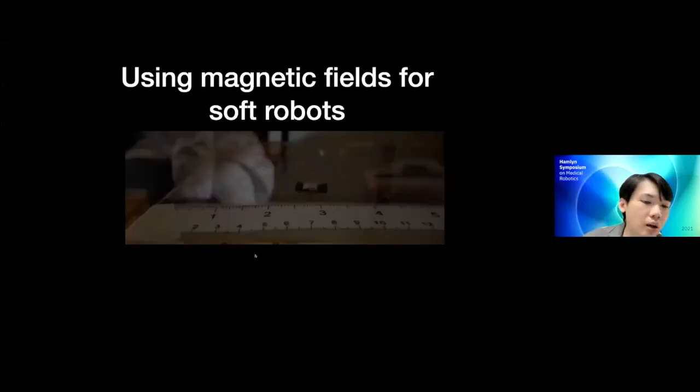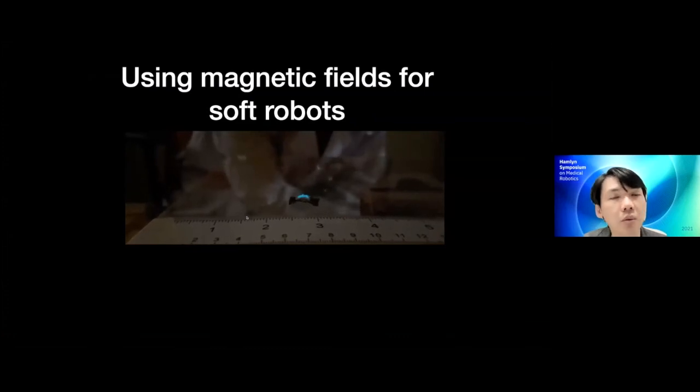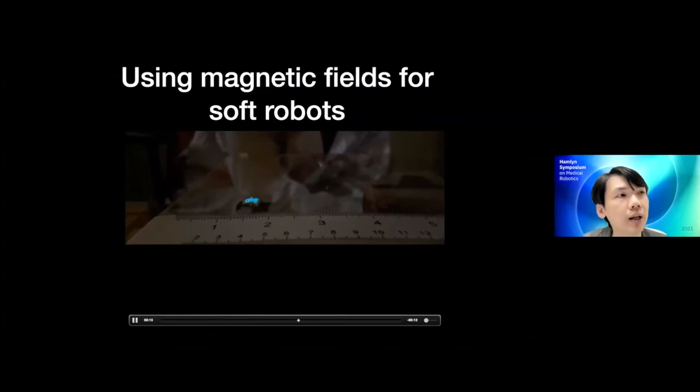So now finally we are starting to piece together different systems that I've shown into a video that shows a robot actuated by magnetic fields, for example, fields that an MRI machine can generate. And you can see that such soft materials can move around. In this case, we didn't wirelessly power the light source, but we have shown that we can do it, just not in this video. You can see that you can make soft robots move without any mechanical contact. It's purely by driving them with electromagnetic fields.